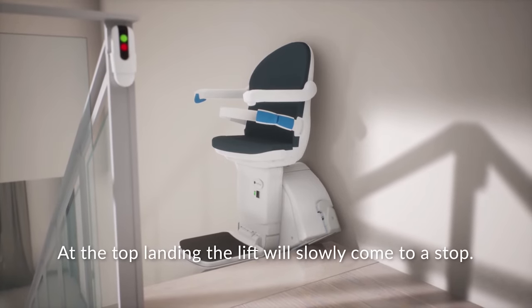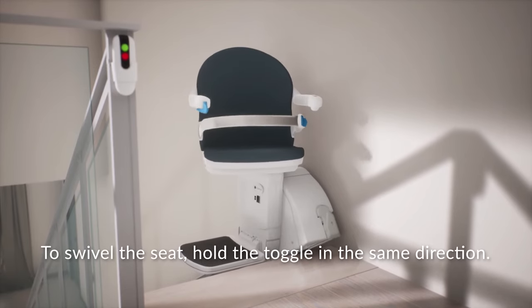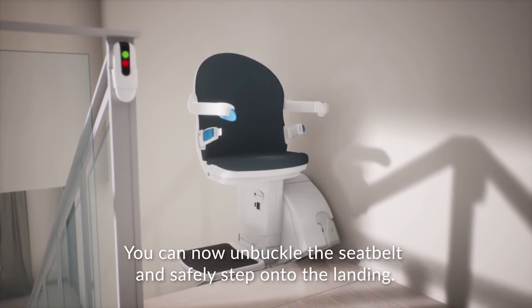At the top landing, the lift will slowly come to a stop. To swivel the seat, hold the toggle in the same direction. You can now unbuckle the seat belt and safely step onto the landing.